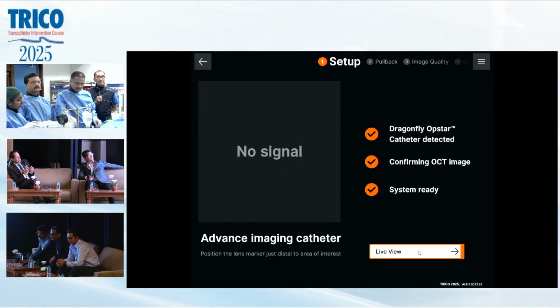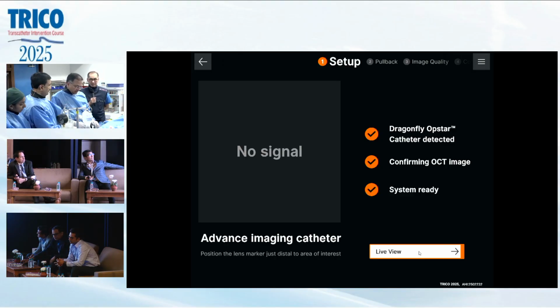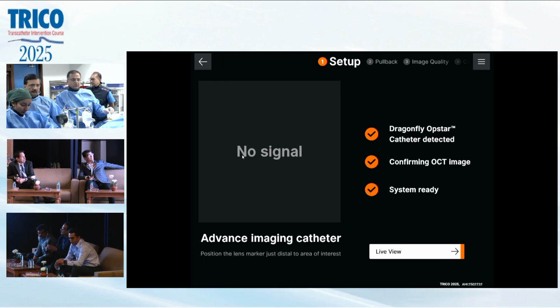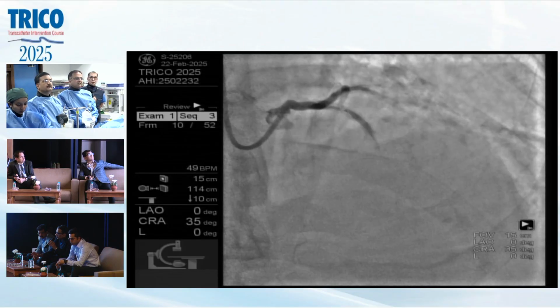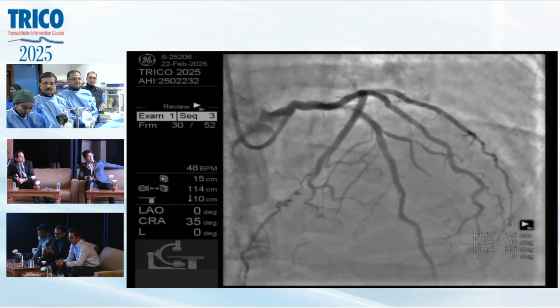One other technique sometimes, Sam, is that if you bring your OCT catheter proximal, inject, then quickly push it down, you might plug a column of contrast. That's true. Although I think we just probably pre-dilate initially and then make enough lumen to have flow around. If it's occlusive, you could inject contrast into the flush port and then follow it up with an injection into the guide. So that's one way to get a good image, even distal, because it's occlusive anyway. So you will get clearance that way.